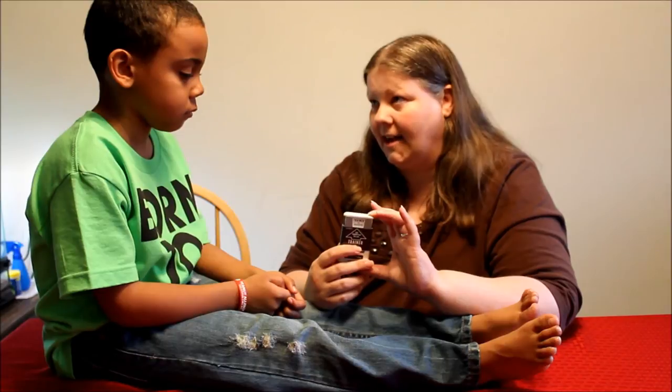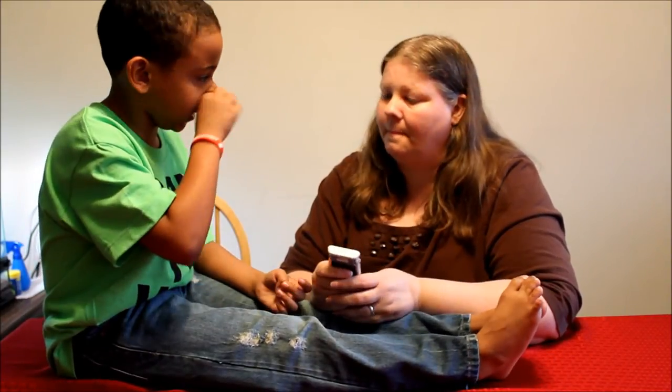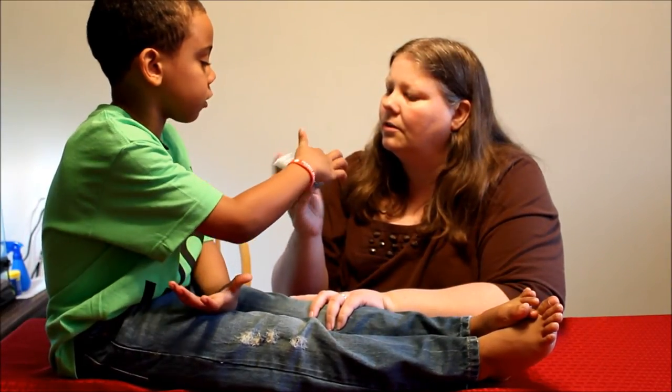The batteries inside last a long, long time — it doesn't need a battery to work, just a battery for the voice activation, and the batteries will far outlast the expiration date. The red light runs on battery too. There you have it — this is the AviQ!